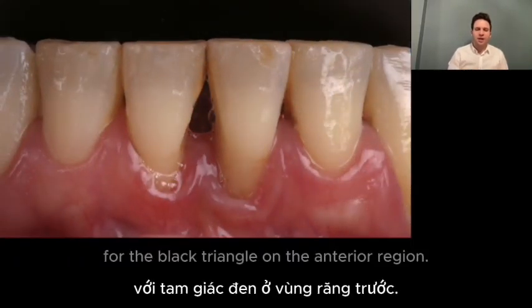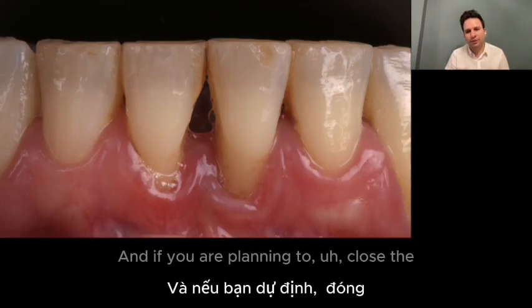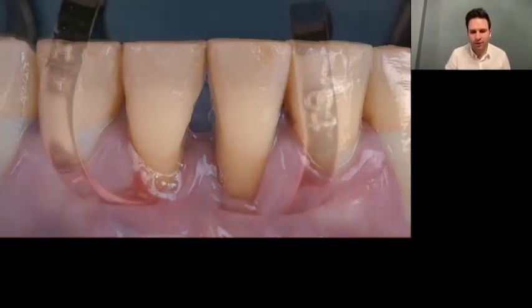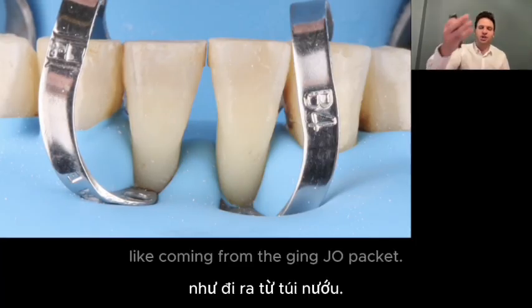Especially for the black triangle in the anterior region, they are very useful to retract the gingiva. And if you are planning to close the black triangle gaps here, you must retract the gingiva as much as possible. Then you can create your emergence profile as if coming from the gingival pocket.